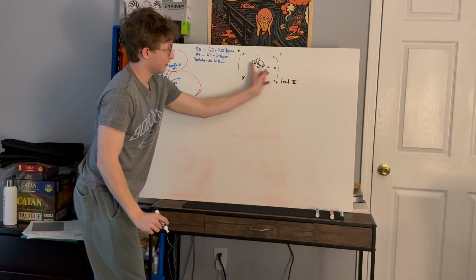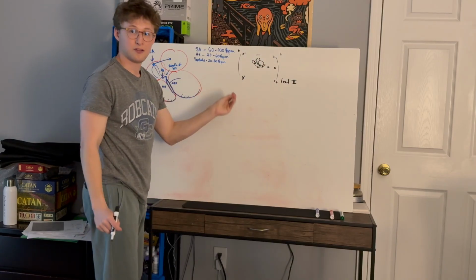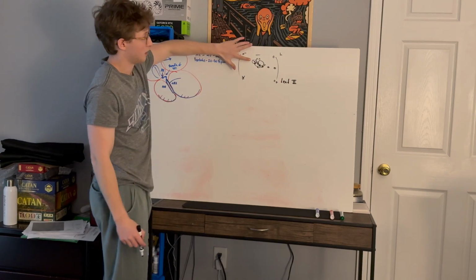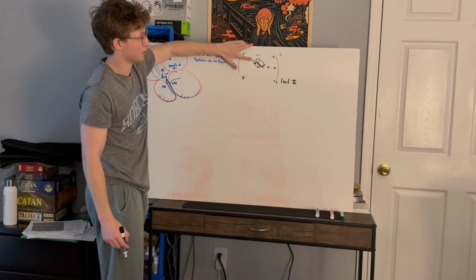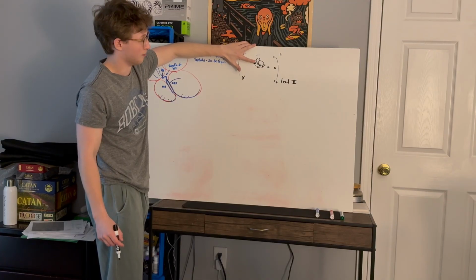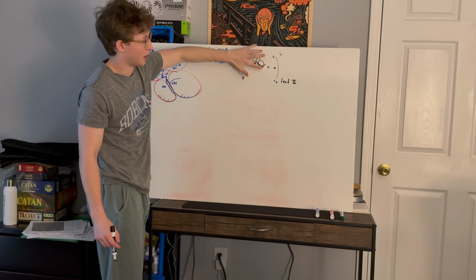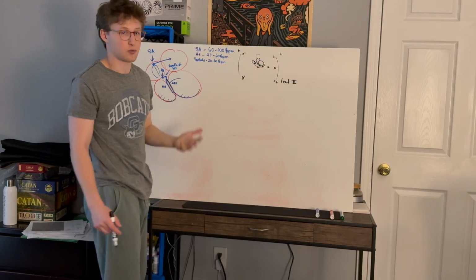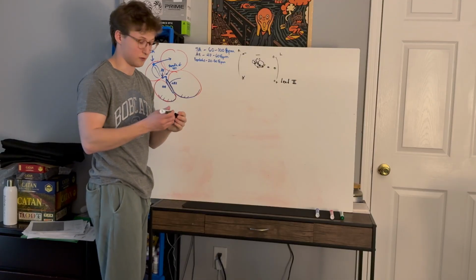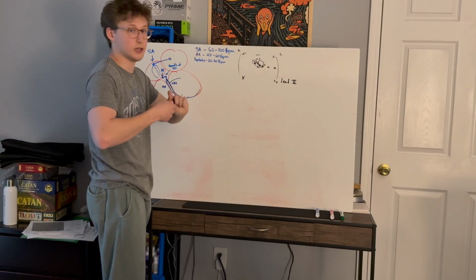This is looking at it like this. It's getting an amazing view, especially of what's going on in the atria, in terms of the depolarization wave that's moving from the top right of your atria to the bottom of your atria, and then to the bottom of the heart and back up to the center. That's why lead 2 is used. And that's what we're going to be looking at for all of our rhythm strips. We're going to be looking through lead 2.